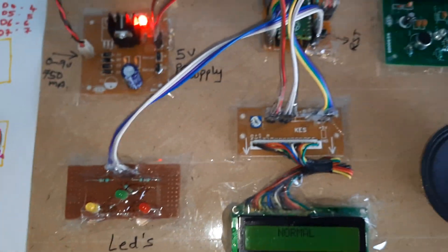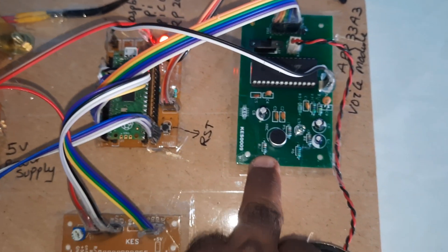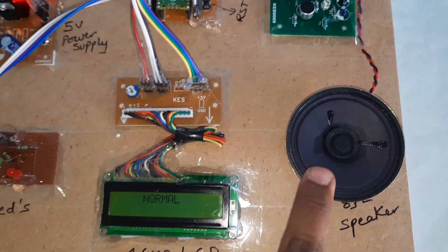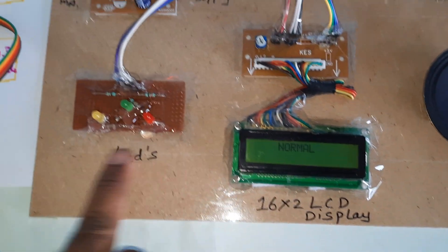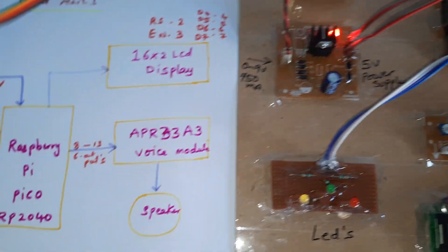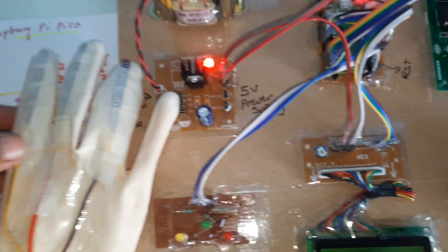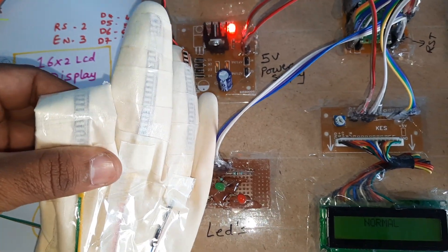Components overview: power supply board, Raspberry Pi Pico, APR33A3 voice module, speaker, LCD display, LED indicators, and the power supply board. This is the sign language to speech conversion system using voice outputs. It uses three flex sensors, and whenever we are bending a finger, it triggers a corresponding voice output.